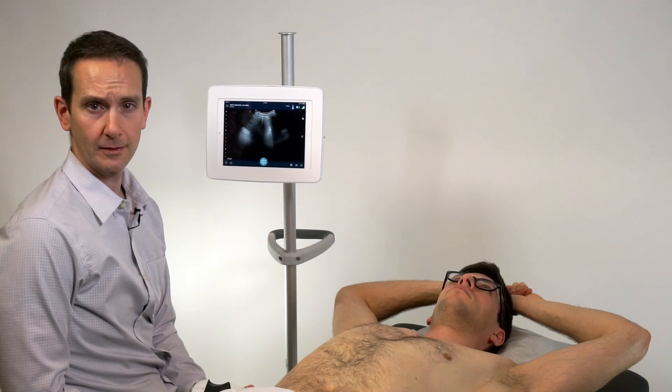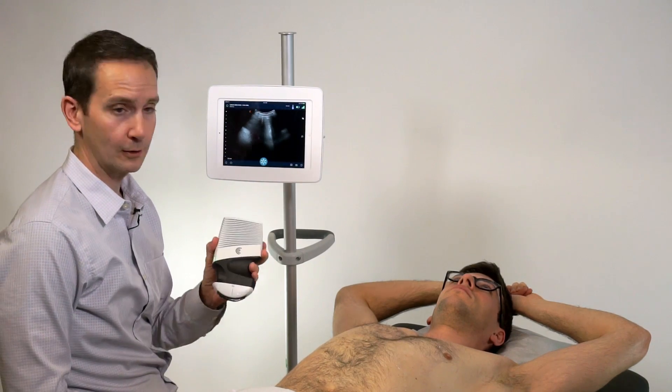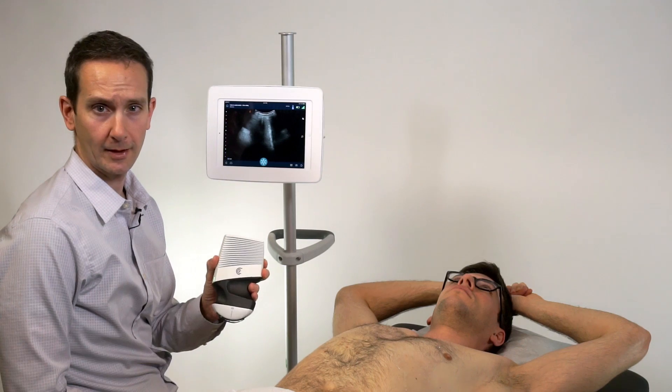My name is Chris Eddy. I'm an ultrasound educator. Today we are looking at the kidneys using the curvilinear Clarius ultrasound scanner.